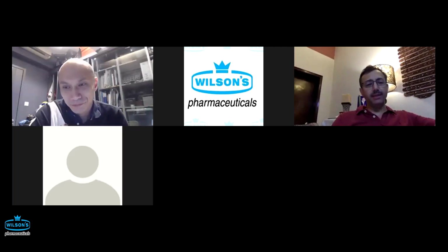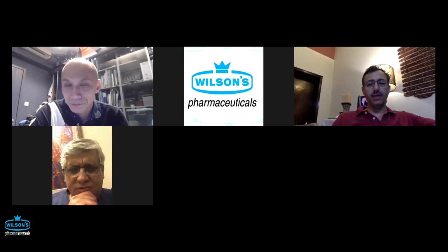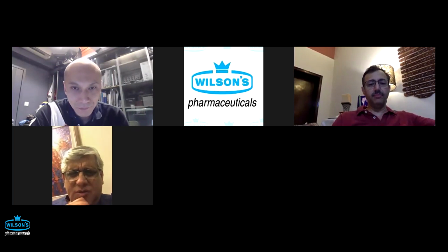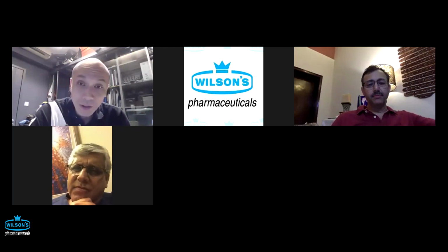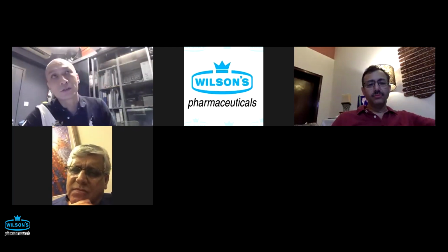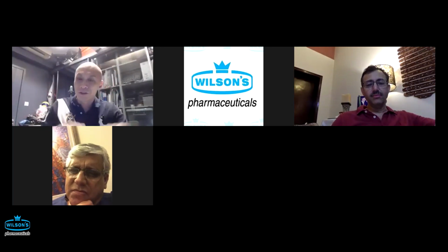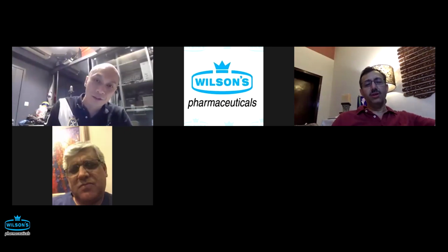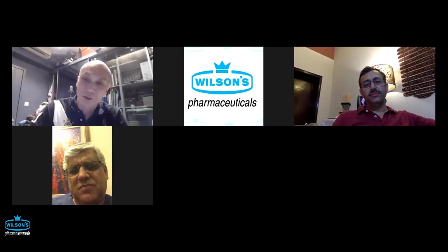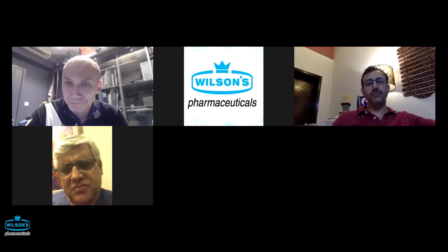Another very interesting question: in case of an impacted basket, are you able to pass the Spyscope easily through the duodenoscope? Is it easy or is it difficult? What is your experience? With a trapped basket, first of all, you need to remove the basket from the duodenoscope and have it separate from the duodenoscope. Only afterwards, once the basket is removed, can you insert the Spyglass into the channel, parallel to the strings of the basket. So you have to take out the endoscope.